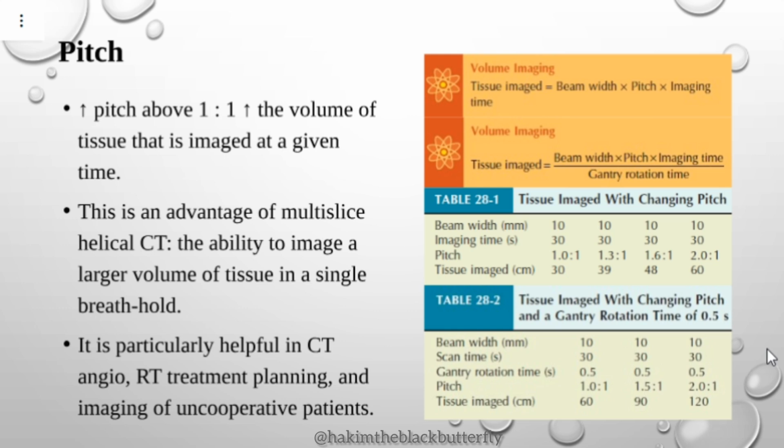So with a pitch of greater than 1, and also with the introduction of multi-slice helical CTs, a patient can be scanned from the head to the toe in just a single breath hold. In just a single breath hold, you can get the images of the entire anatomy within seconds.